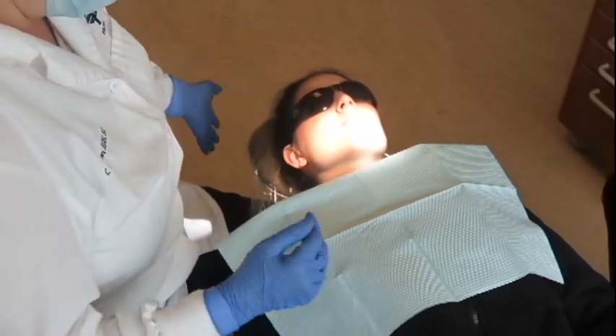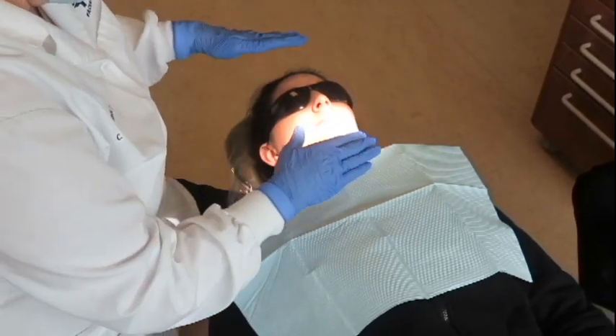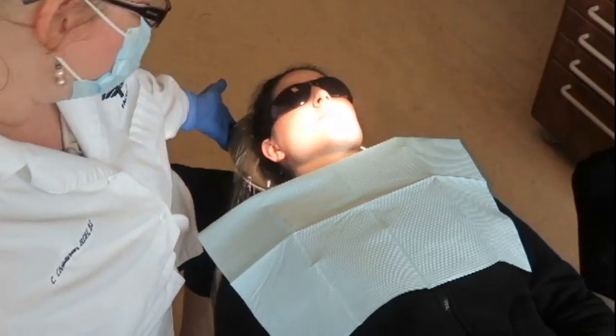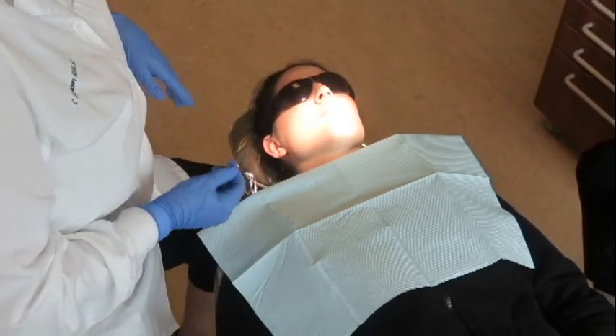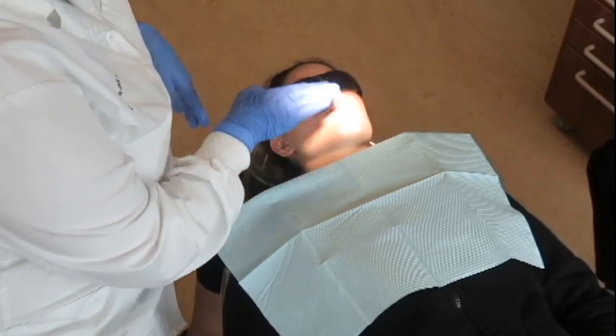My patient is right at about the height of my elbow, maybe even an inch lower than what you would normally put your patient. And it's really important to make sure that their face is parallel to the floor.